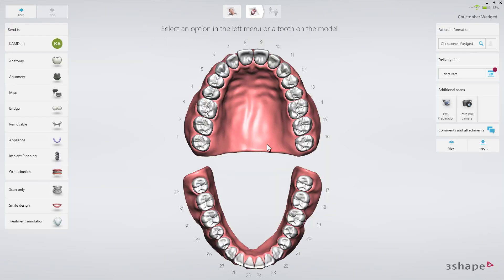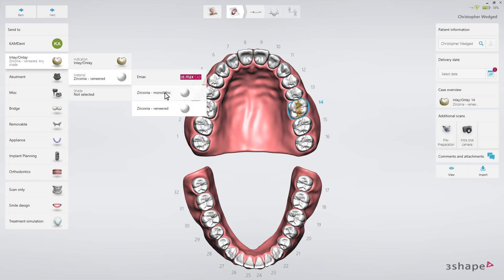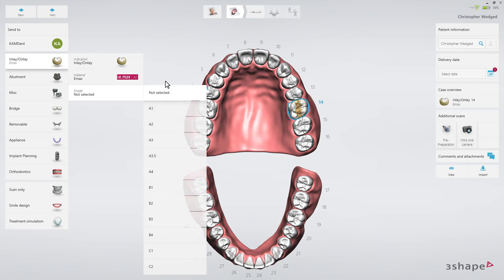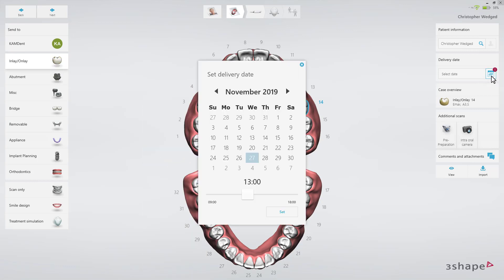On the order form, select the tooth on which the restoration is planned. Select the Anatomy tab and select Inlay-Onlay. Select Material from the Material drop-down list and select the Shade from the Shade drop-down list. Finally, set the delivery date by clicking the Delivery Date button.